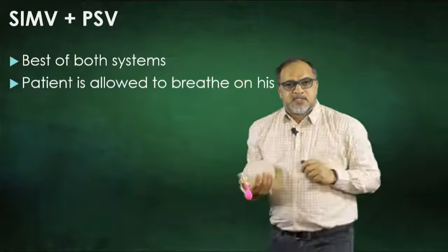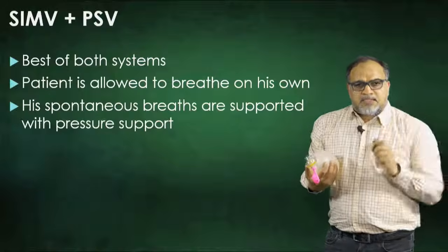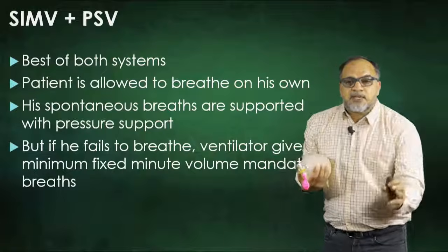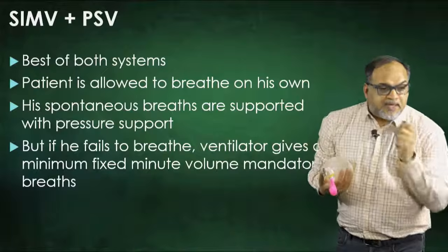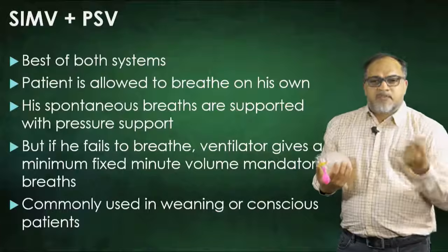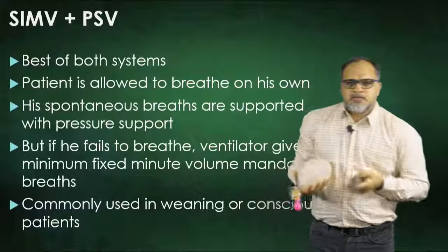It is the best of both systems. The patient is allowed to breathe on their own. The spontaneous breaths are supported with pressure support. But if he fails to breathe, the ventilator gives minimum fixed minute volume mandatory breaths. It is commonly used in weaning or conscious patients. Let me show you two diagrams to explain it even better.